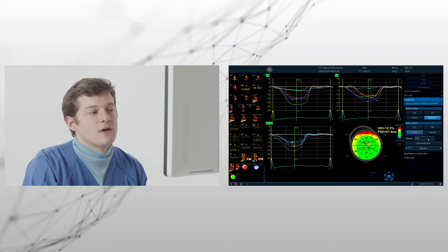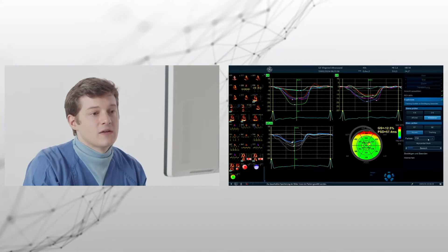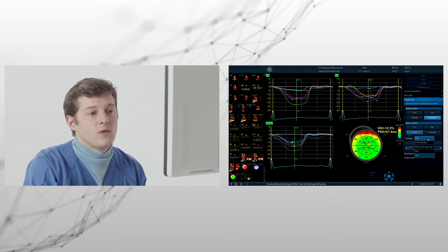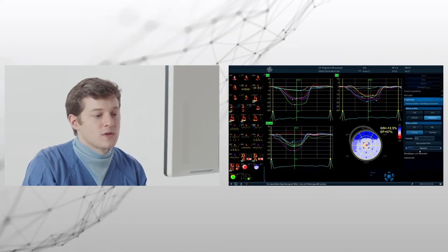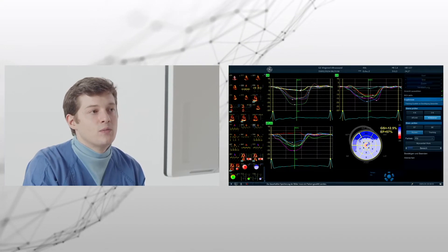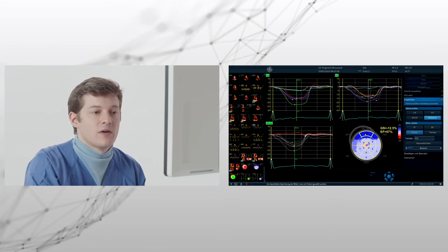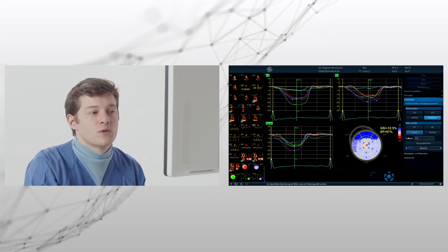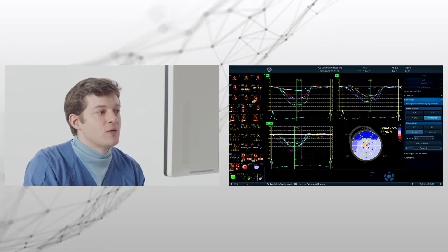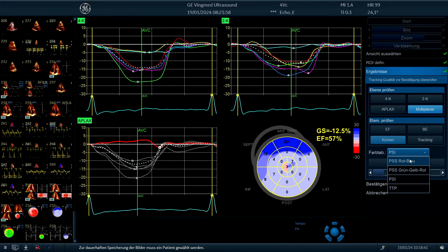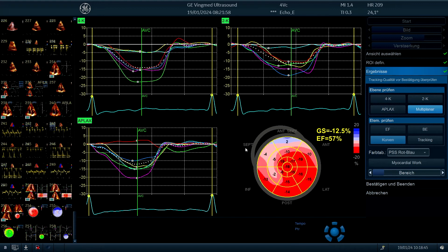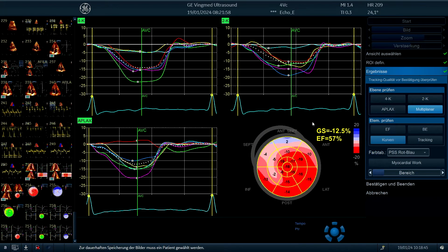Now also the curves we can save and evaluate for all situations for the post-systolic index, so blue means post-systolic, so after systole we have the most shortening. Here we have the aortic valve closure, you can also check out the specific electron strain imaging, and here we go back to the normal bullseye display we know.